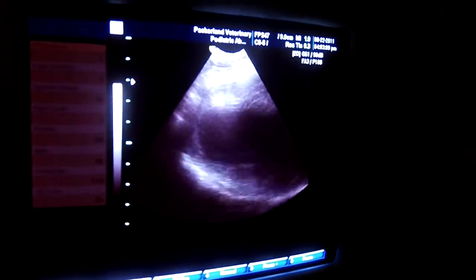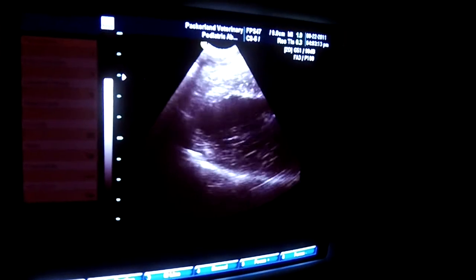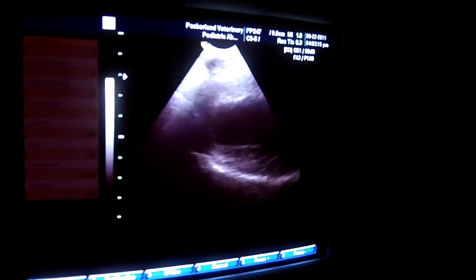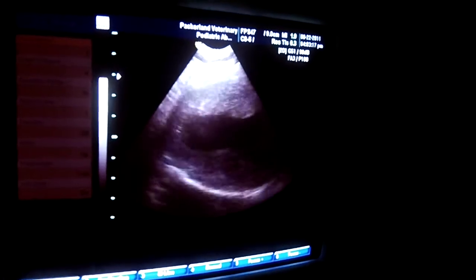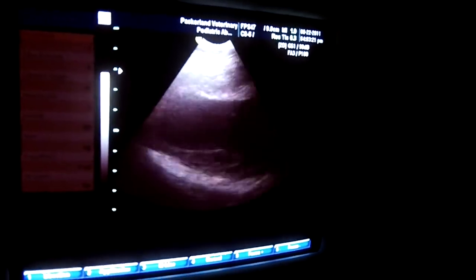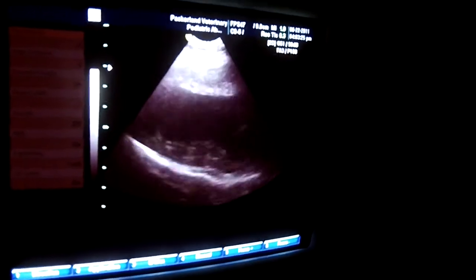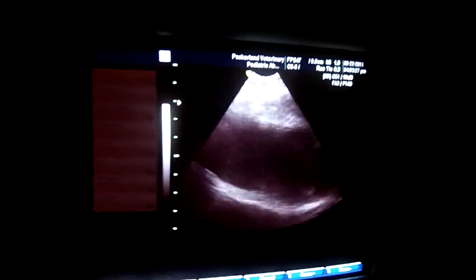You can see that we've got a mitral valve that is thickened and not happy. We're going to put a color flow over it and see if we've got a leaky valve, which I am positively doing. In fact, I'm going to ask you to reach over and hit color.